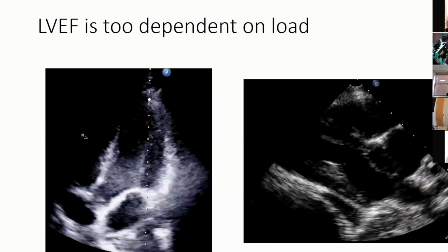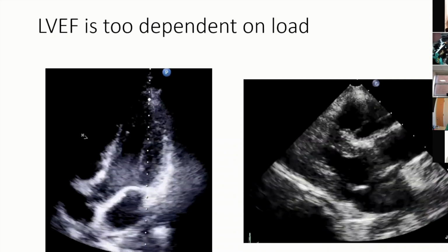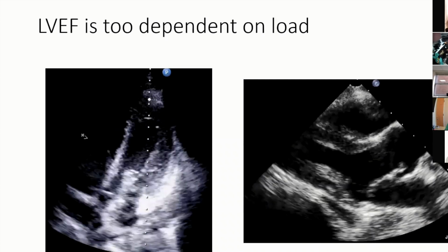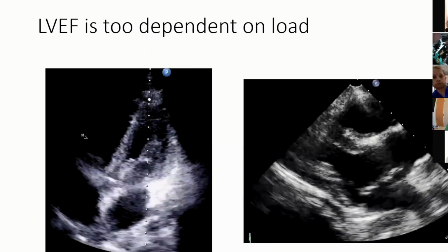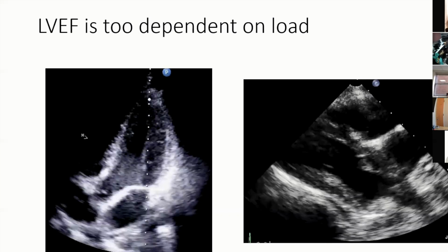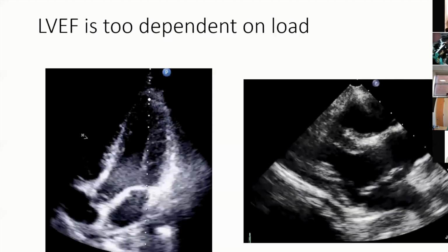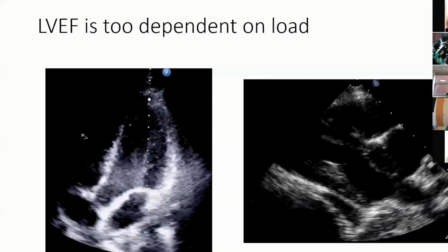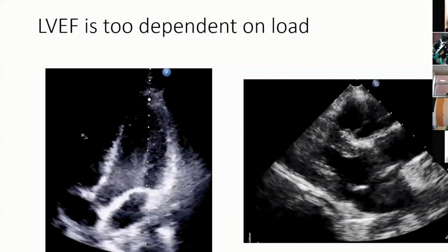So I'm going to show you this picture right here of someone who is, we would call it, hyperdynamic and hypovolemic. This person is a septic shock patient who's got low afterload, maybe low preload as well. They are contracting vigorously. Now, when the first septic myocardial literature was described in the 1980s, it was defined as low ejection fraction and probably a little bit of dilated LV.